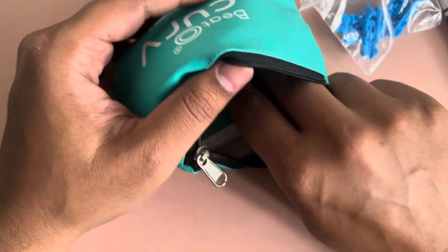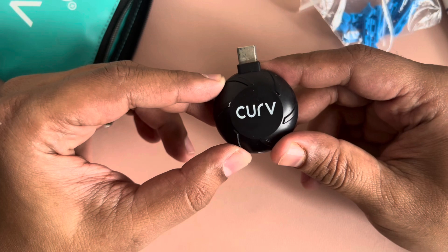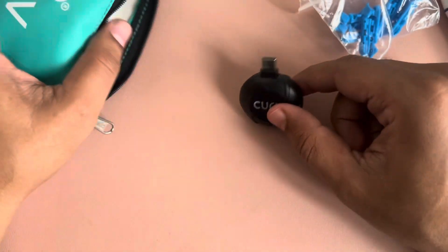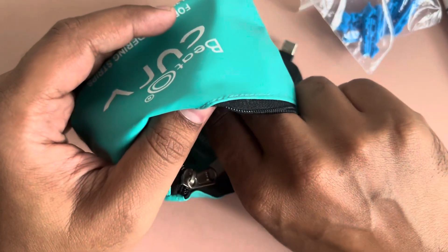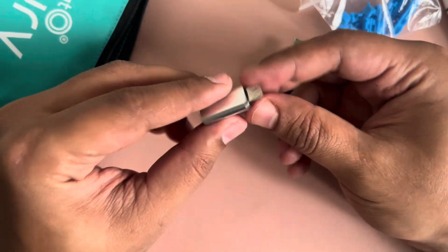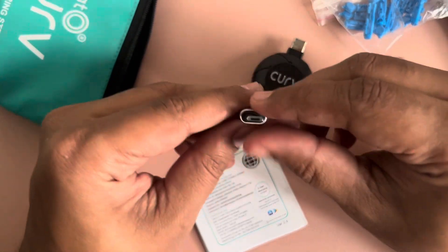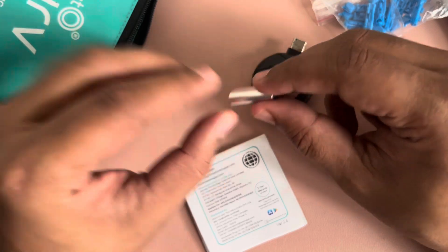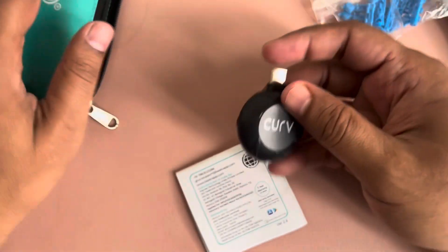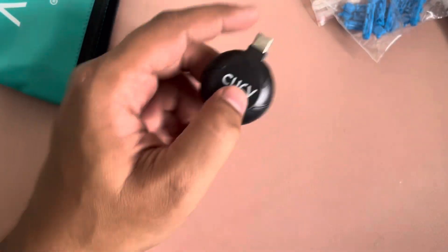So apart from that you get the Beto Curve which you can insert directly onto your Android phone if it is Type-C. Or if yours is an iPhone, they provide a converter. As of now this is micro USB. The iPhone converter is missing, so we don't need the converter — just need the device.